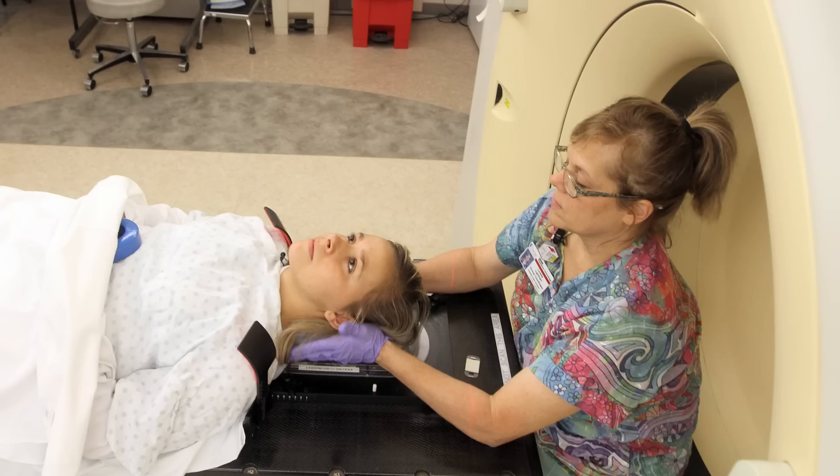Nothing's gonna hurt. You can see and you can breathe through the mask. It'll be a little warm and wet.